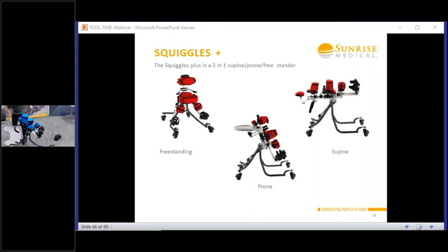I've made it look really awkward now, which is fine. Because we've just done it on the spur, what you need to do is drop the headrest as well. Put the actual push handle out the way and change the tray position just to allow the tray to get in. So giving you that prone standing.